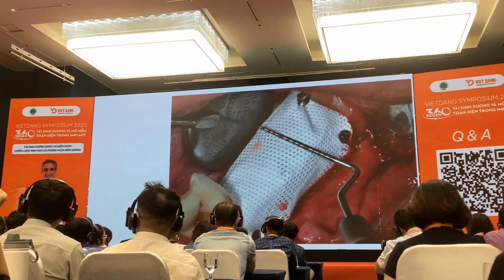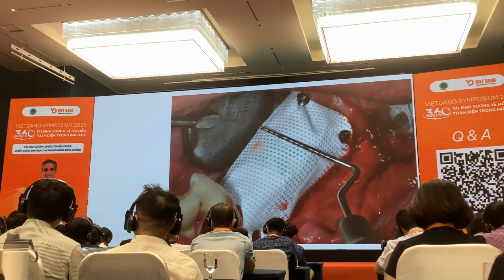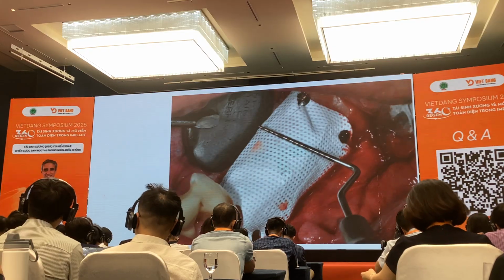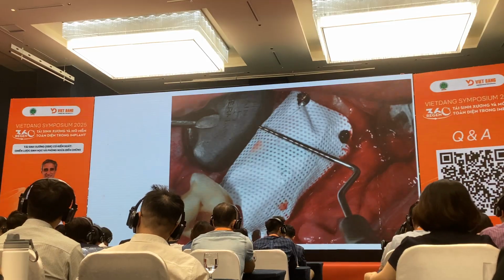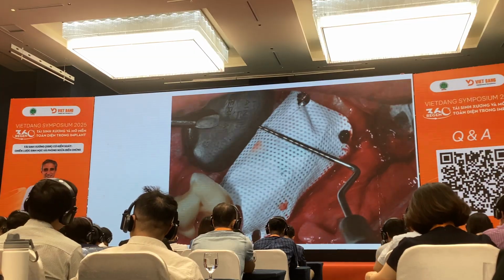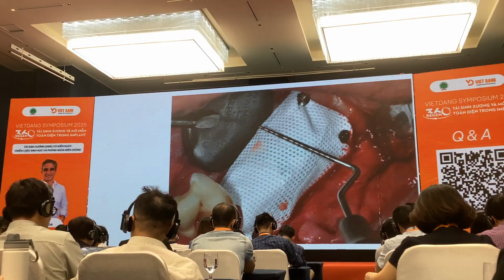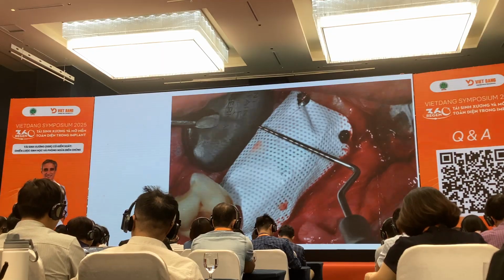But this is the time to place the periosteum against the bone. Fortunately, it is the right time for the contribution of the periosteum activity. The periosteum has to be placed over the top of the bone with the perfect closure of the flaps in order to protect the delicate bone.